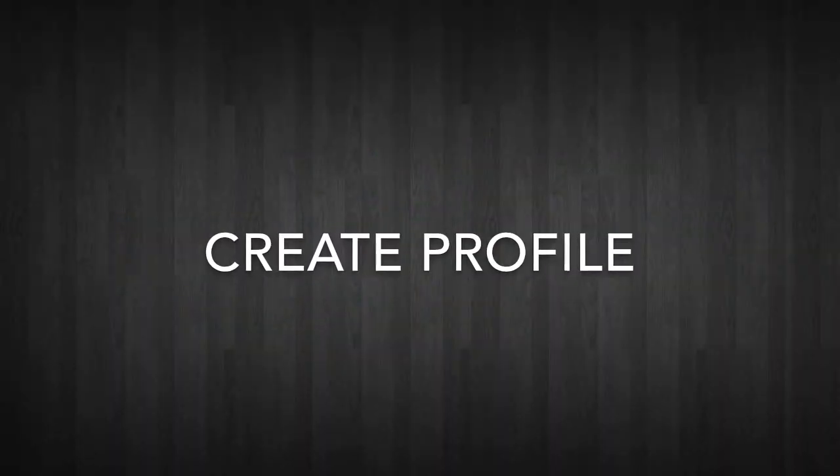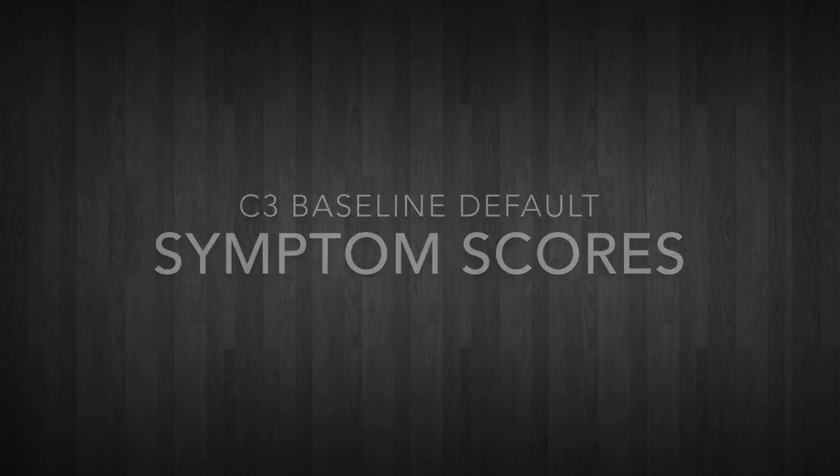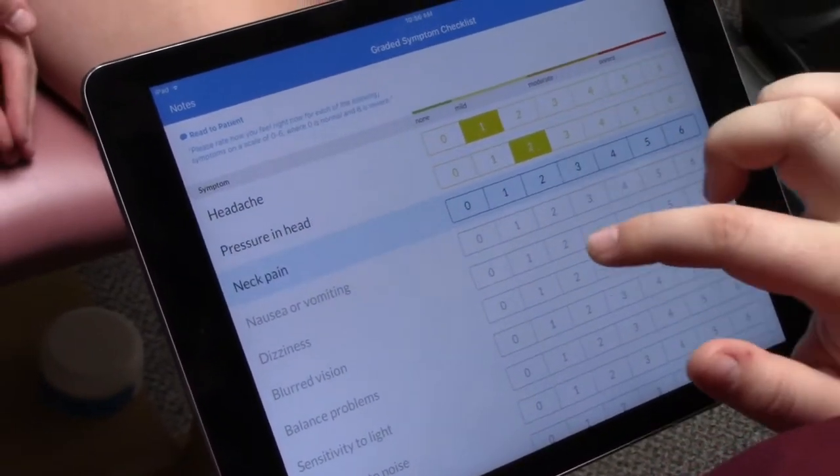When an athlete arrives, a profile will need to be created. A Safe Sports Network staff member will be helping to check kids in and provide instruction on this process. Once the athlete is checked in, they will need to answer and grade any current symptoms that they may have.